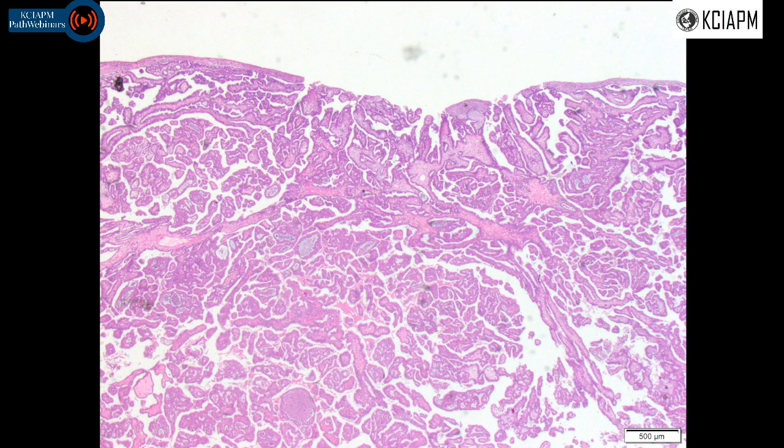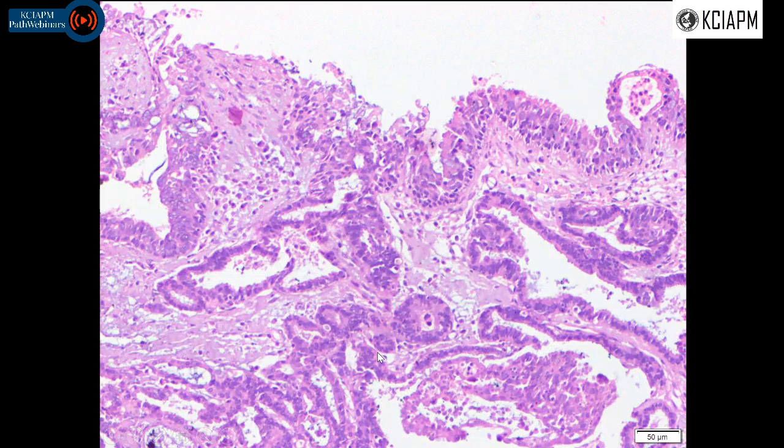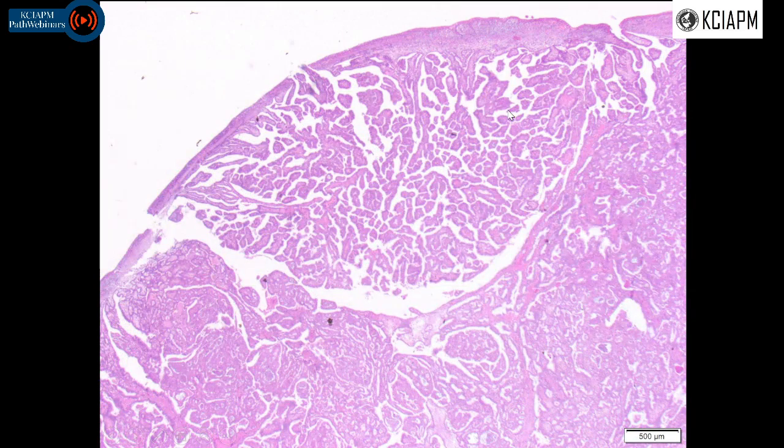I said, okay, if this is a papillary carcinoma of the thyroid, where does this epithelium come from? So my thoughts went on to whether it's arising from a thyroglossal cyst. This was a pseudo-stratified surface epithelial lining, and this was the lesion arising from it. Better seen in this section, we see that this tumor is in continuation with the surface epithelium. And this section highlights the papillary configuration. Definitely the lesion looks polypoid.